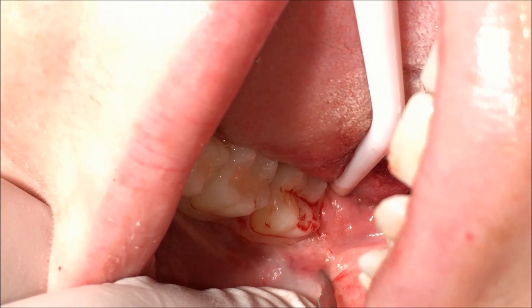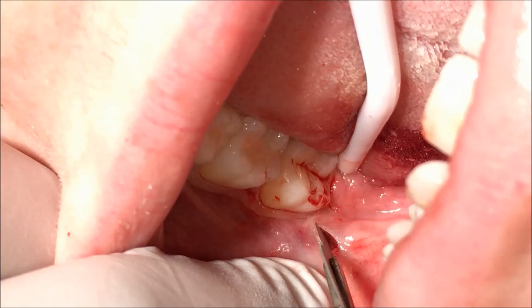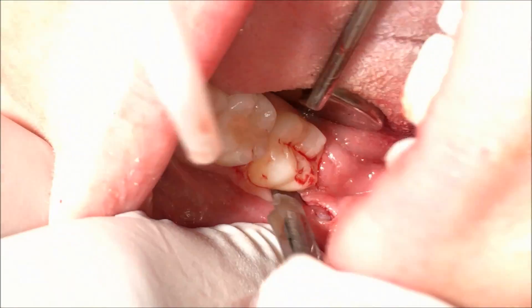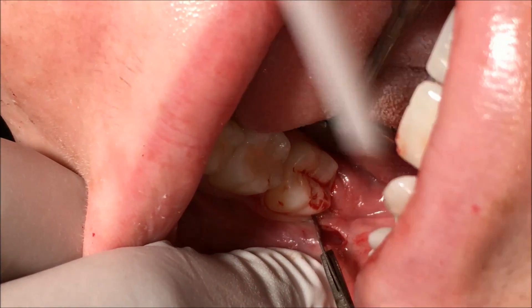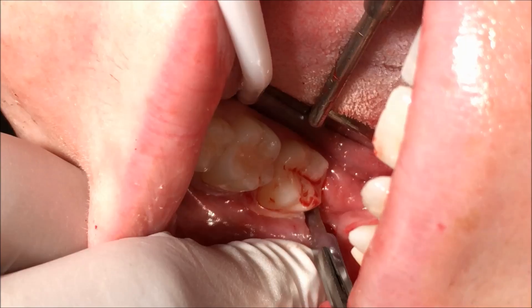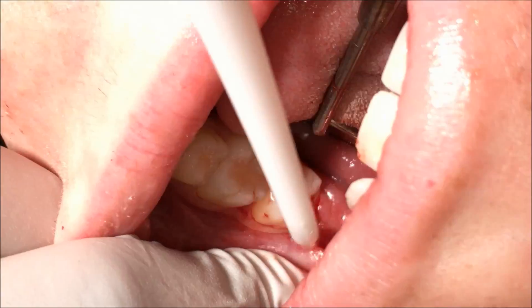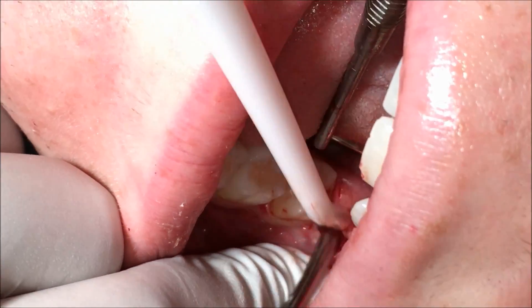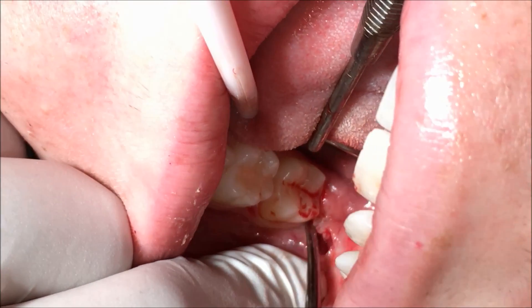My usual envelope flap — it obviously cops a bit of criticism online, and it's not a flap for beginners. I have done this for many years, probably around 8 or 9 years, and the flap is usually very similar to this. Characteristics are no mesial relieving incision and fairly conservative. This one here I've brought around to the mesial of the 7.